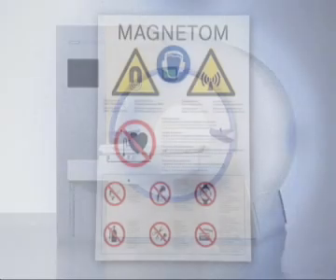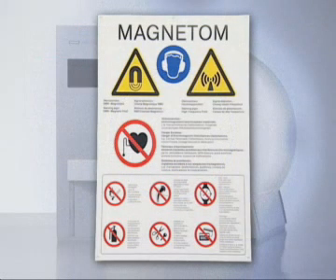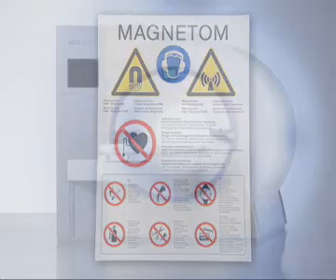If you are aware of the effect of the magnetic field and observe the safety instructions, MR is a safe modality for a quick diagnosis. It affords unique views of the interior of the human body without ionizing radiation.